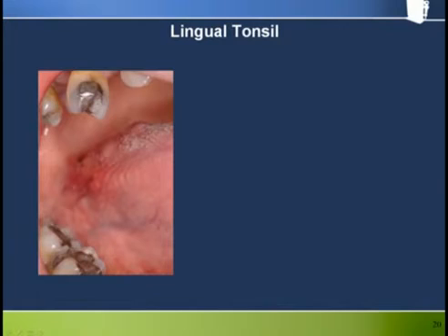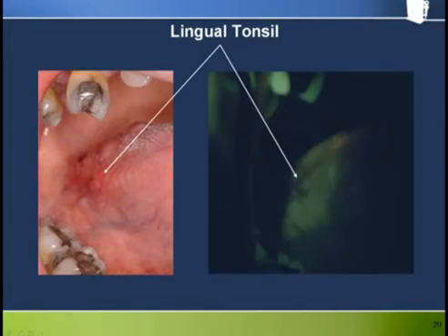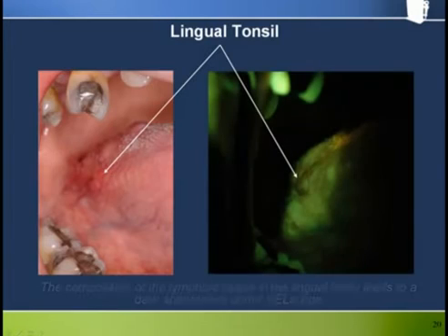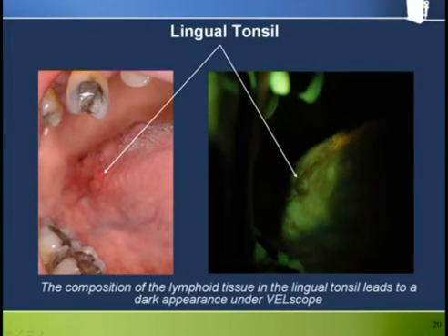After seeing the pronounced loss of fluorescence associated with lymphoid tonsillar tissue, it should be no surprise that the lingual tonsils also present quite darkly under fluorescence visualization.